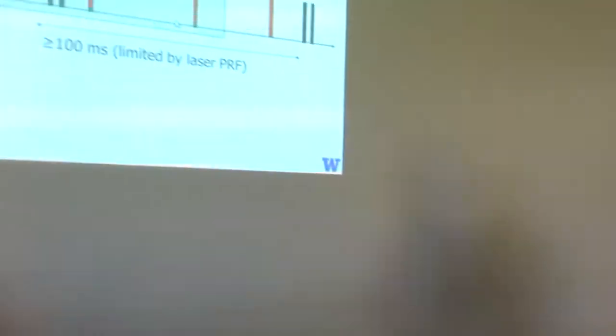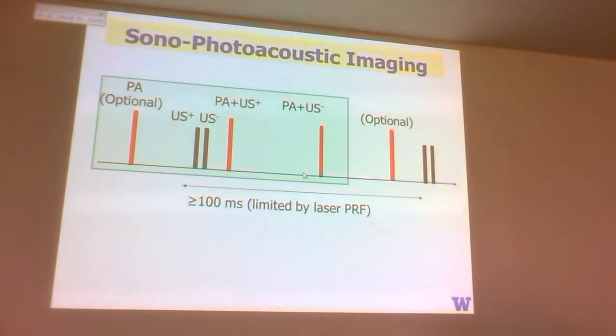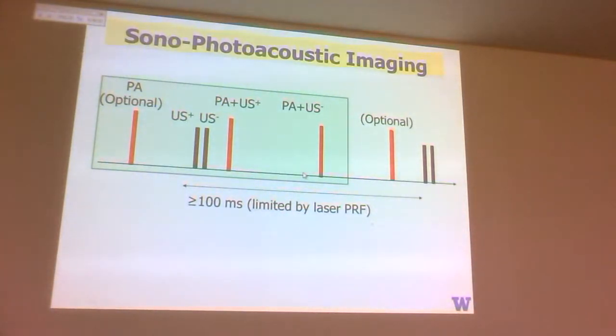All right? But we can use that to our advantage later. Okay. All right. Now you're not ultrasound people, so I'm sorry, I made this graph like what ultrasound people do. But there is a standard imaging technique in ultrasound called pulse inversion, or nonlinear imaging. And the idea there is you take advantage of the second order nonlinearity you have for acoustic propagation in the body. And the way you make an image is you do two pulses.